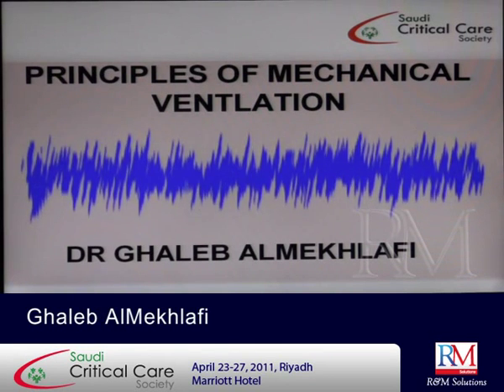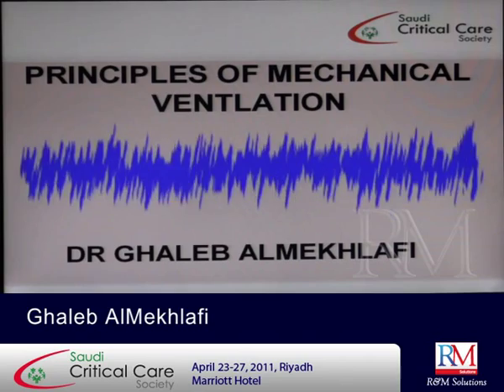So if we are doing this mechanically, we are doing it as it happens normally, spontaneously. If we do this mechanically in a patient who is, say, paralyzed, we are doing what's called negative pressure ventilation, but this is mechanical, okay.